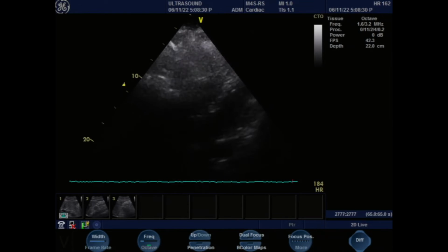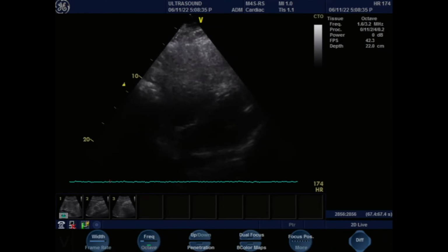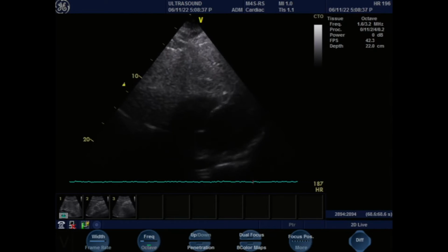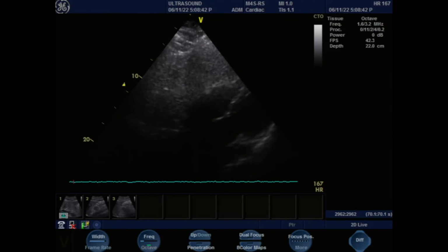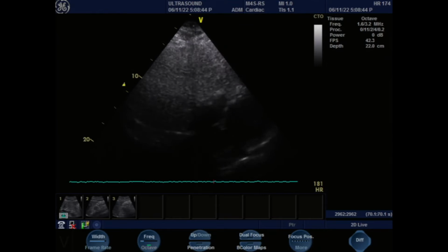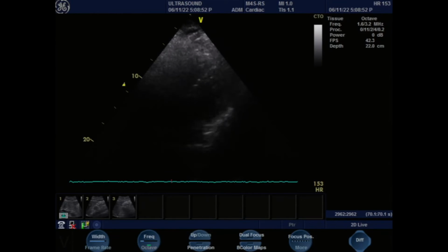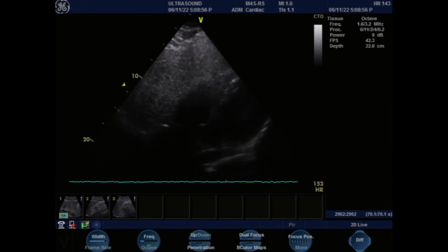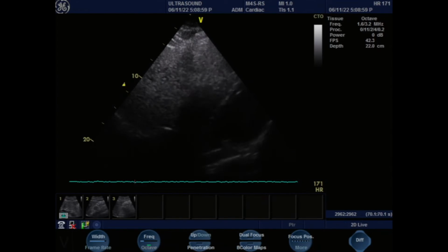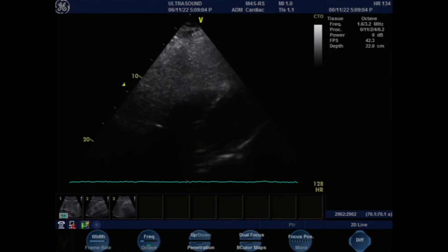All right, so what we're looking at over here. You can see that there's a different kind of structure. You see this thing? It looks different, right? That's your liver. You can see the texture of the liver is different from other tissues. If I put the probe over here, this looks different compared to over there. So this is the liver, and right next to the liver is the right ventricle, and this is the left ventricle.